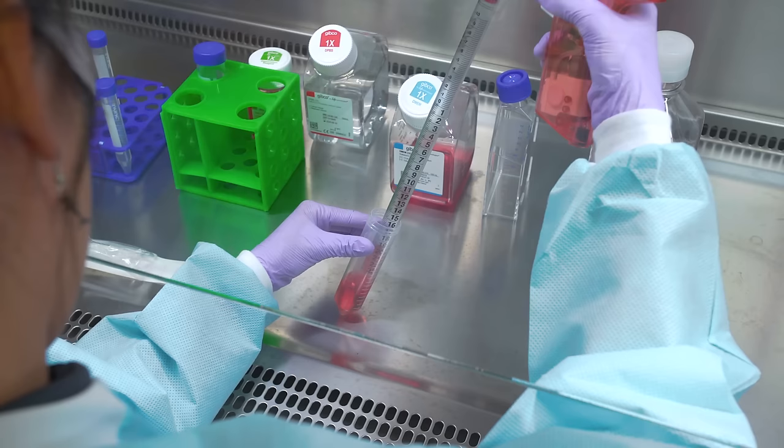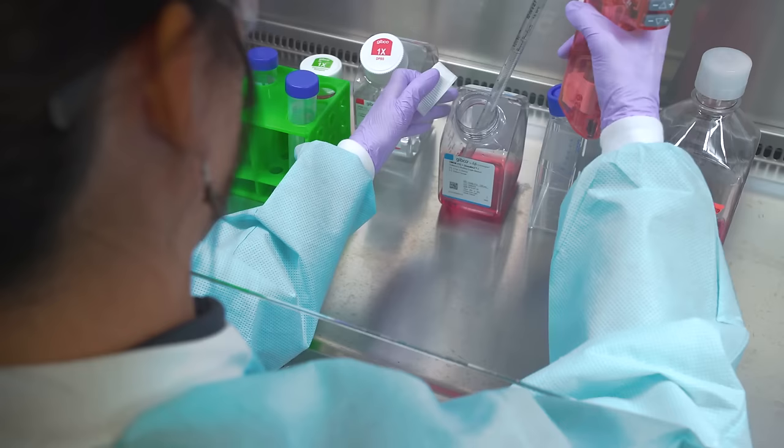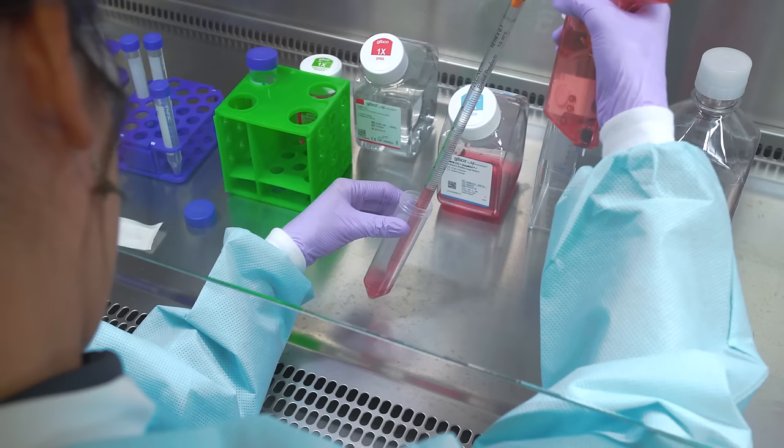Remove the medium from the centrifuge tube with a pipette and discard the medium into a waste container. Try not to disturb the pellet. Resuspend the pellet with warm, complete growth medium. Gentle pipetting will disperse the cells to ensure a homogenous solution of single cells.